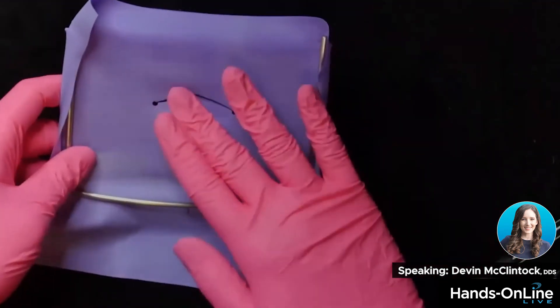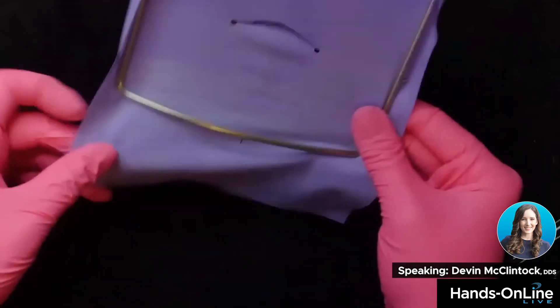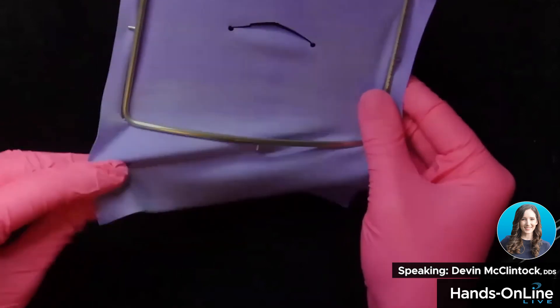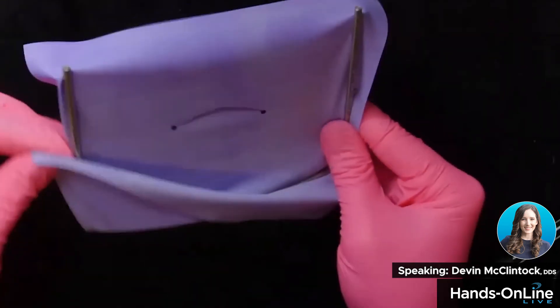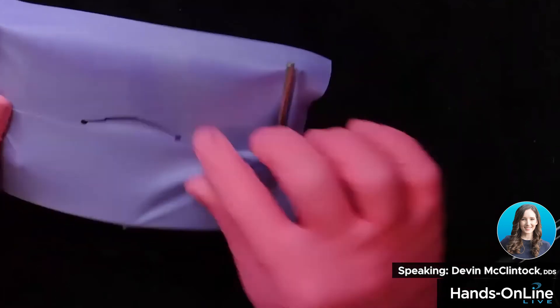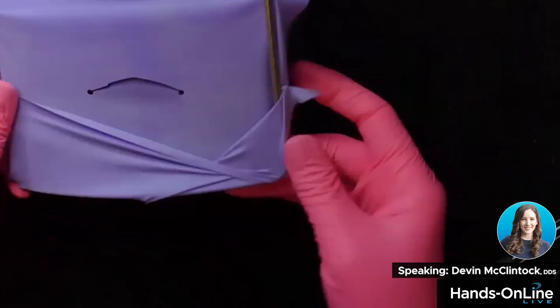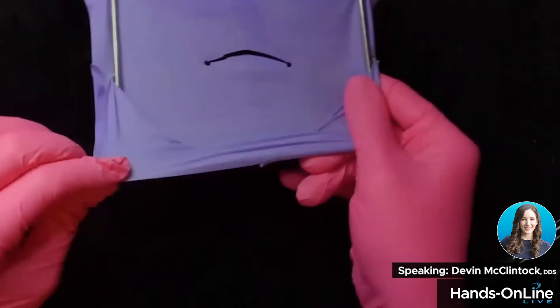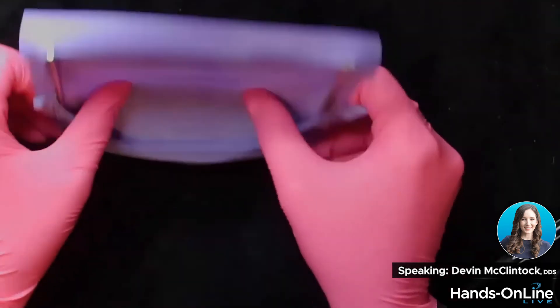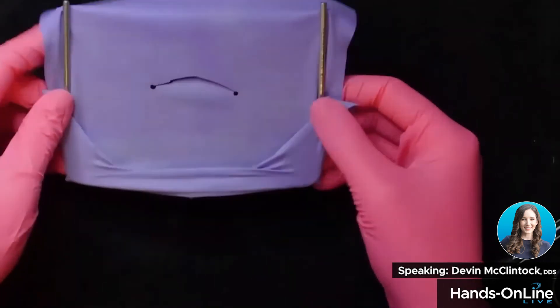You can also do a half dam. You have these little hooks here on the side — you can literally just go like that, and you're still getting a good amount of the dam, having that depth and reservoir without stretching the dam too far.